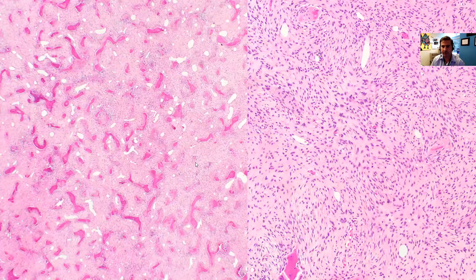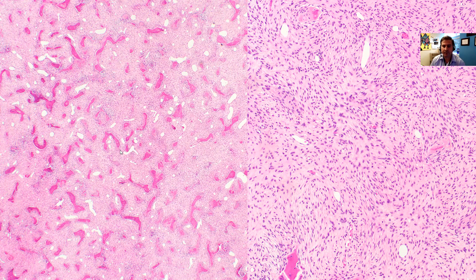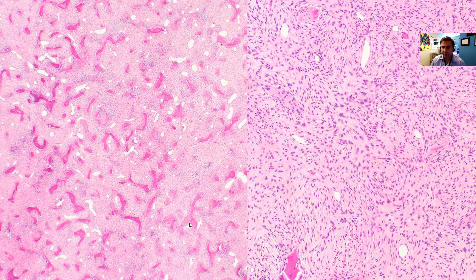Tissue was obtained, and on the left side, you see a low-power view of randomly arranged trabeculae of woven bone. The trabeculae of woven bone have an interesting pattern showing some that almost look like alphabet shapes — this looks like an N, over here perhaps a U, this trabecula of woven bone looks like an upside-down state of Florida, and maybe we have a dinosaur here or even an upside-down wiener dog. This pattern is quite unusual and gives us a clue to the diagnosis.